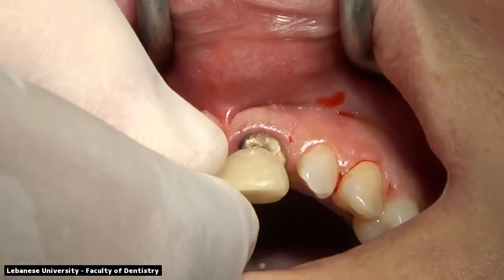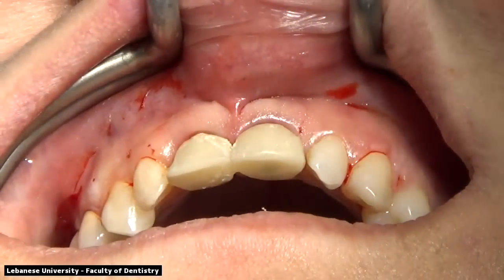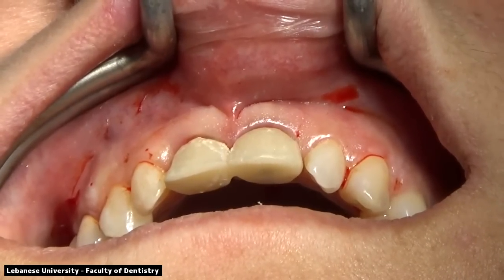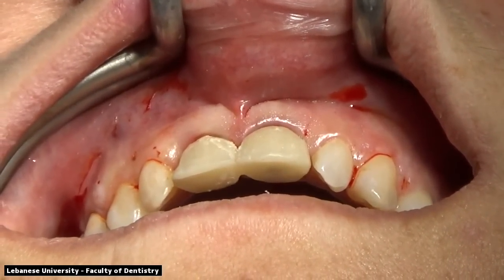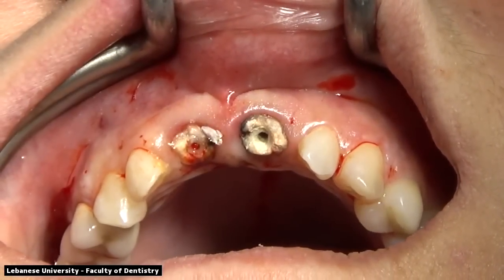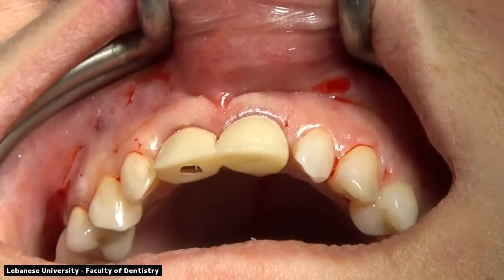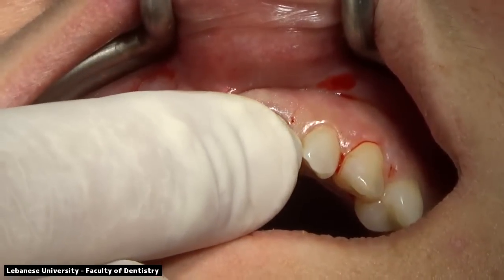Okay, so we're currently trying the temporary restorations that will be placed afterwards. We're keeping them inside so that we can use the periotomes and we can easily extract the teeth. So these are the new temporary restorations that we are trying right now. They were placed on a better gingival inclination and a better profile. You can see that there is a slight opening on the lingual side.